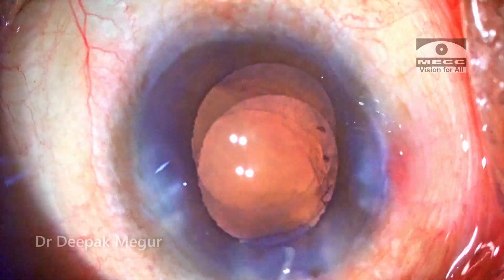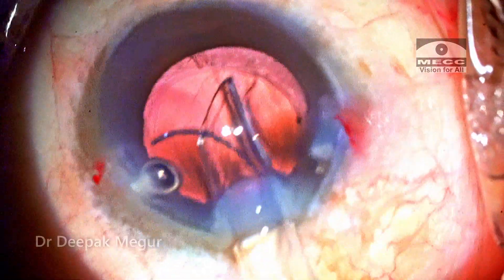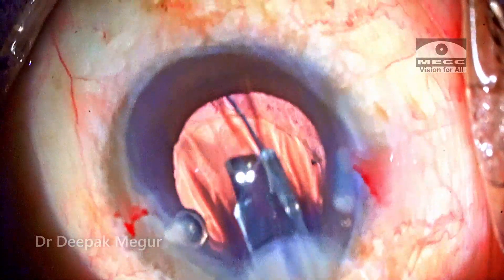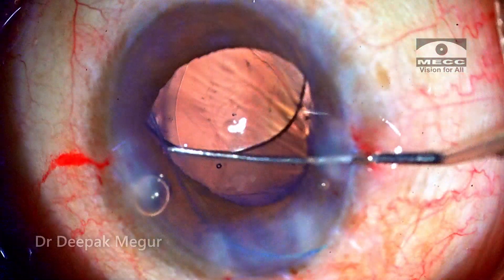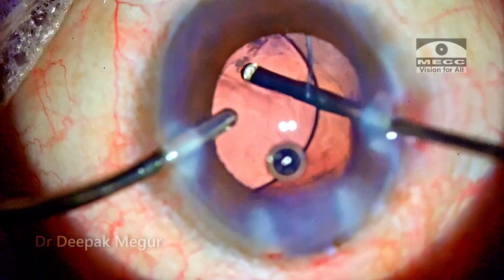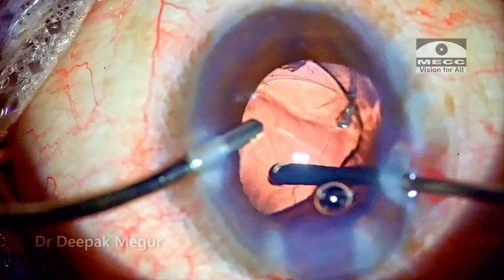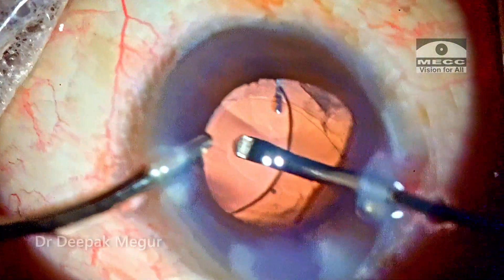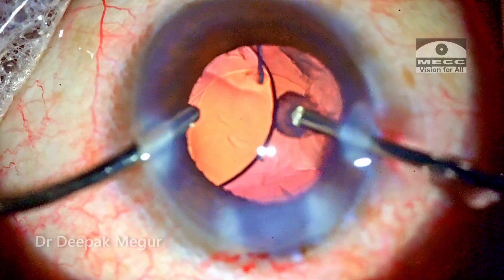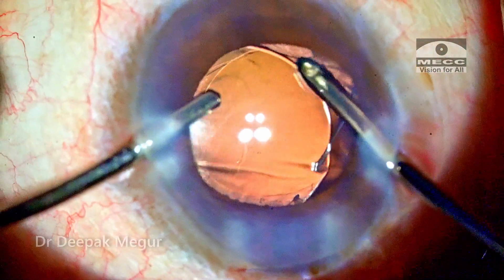Time to implant the lens. I'm using sodium hyaluronate — a cohesive OVD — to create space between the iris and the anterior capsule. The appropriately powered multi-piece lens is being loaded, and the distal haptic is placed first above the anterior capsule, followed by the trailing haptic. The lens is dialed into the sulcus. I go back in with the vitrector under the lens to clear off all the OVD which may have gone into the vitreous cavity, and at the same time I'm trying to aspirate any remaining lens matter with the cutter.